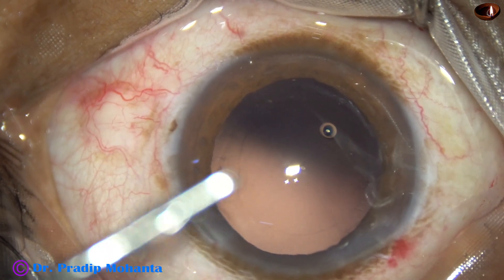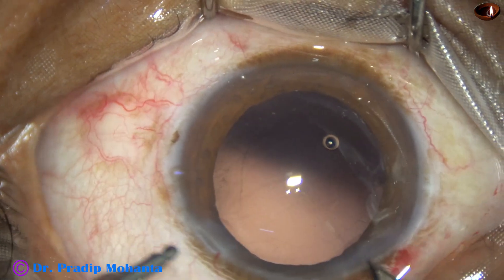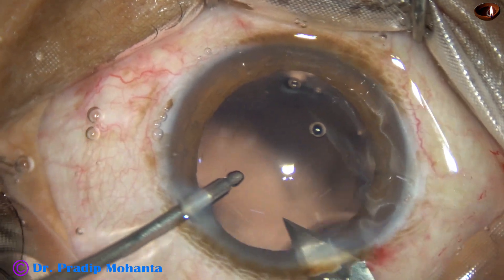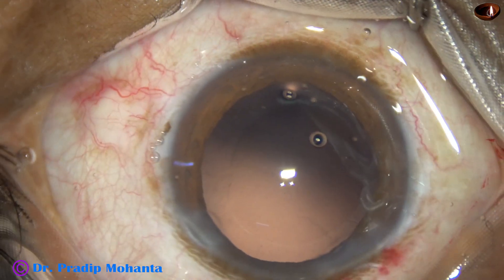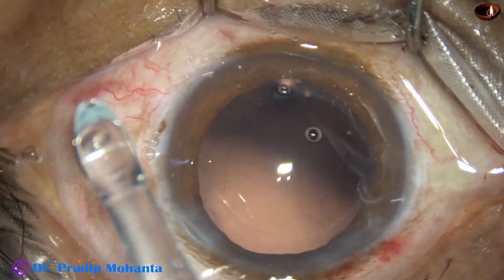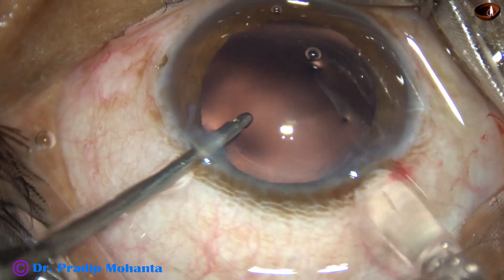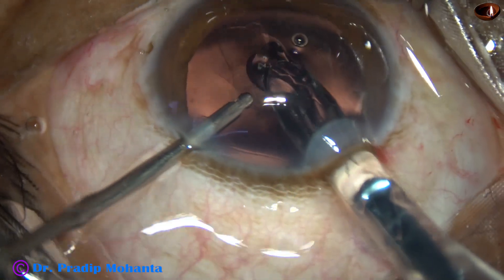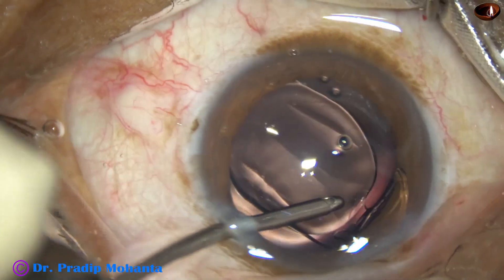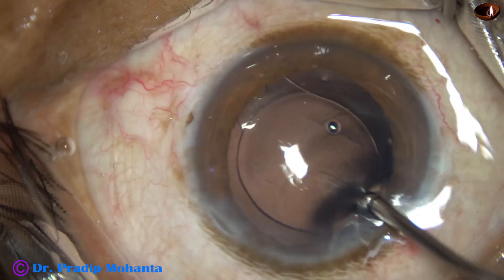It is time for implantation of an intraocular lens. The main incision is enlarged a bit because I am using a wide-bore cartridge. This is called hydro-implantation, where you keep the anterior chamber formed by an irrigating cannula and inject the IOL in the back. Just by a push of the irrigating cannula, the trailing haptic goes into the bag.